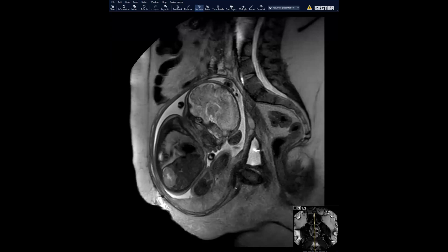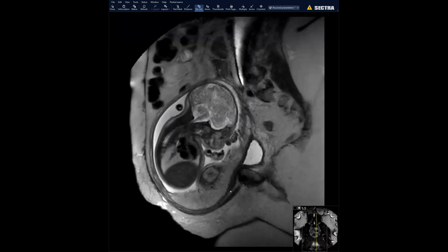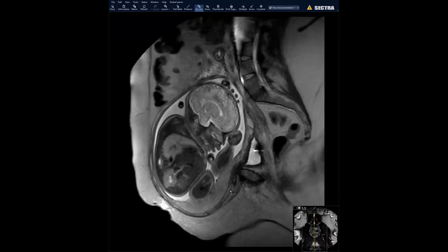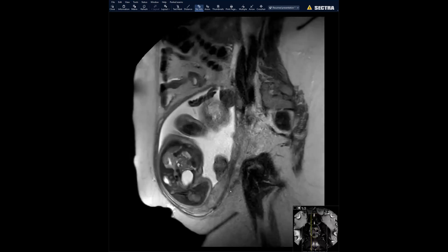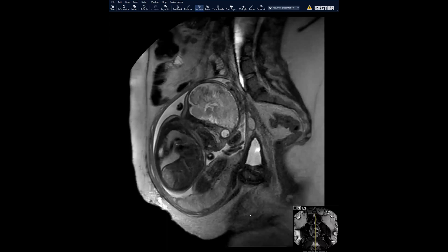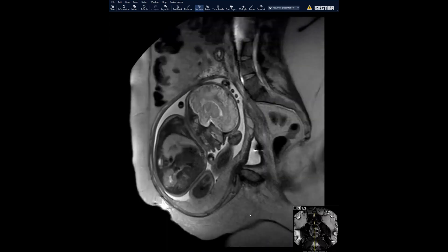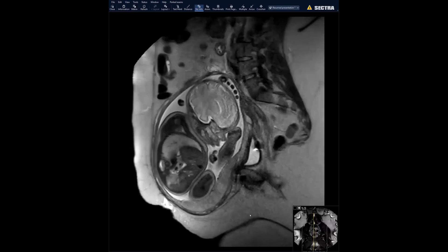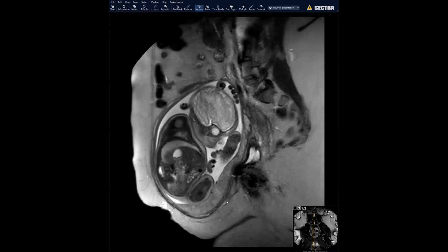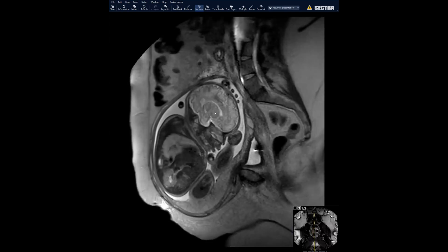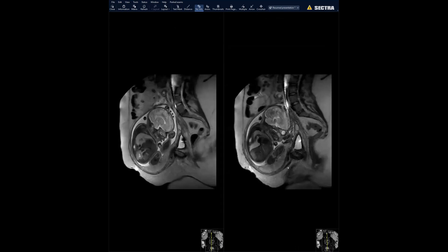A 20-something week pregnant patient — kind of a show and tell case. We've seen two variants of this before. Looking at the current scan: is this the trapped uterus? It's like flipped in front of the bladder. Yes — there's the bladder, this is the cervix, and the entire uterus is anteriorly incarcerated. Look at the position of the baby — this is breech. This is her previous scan.